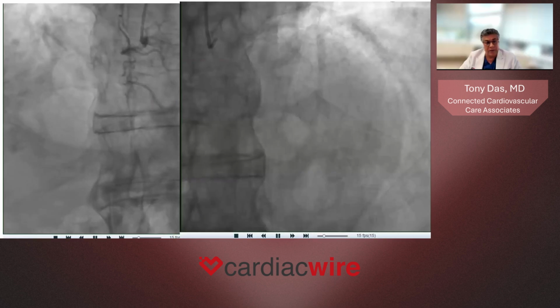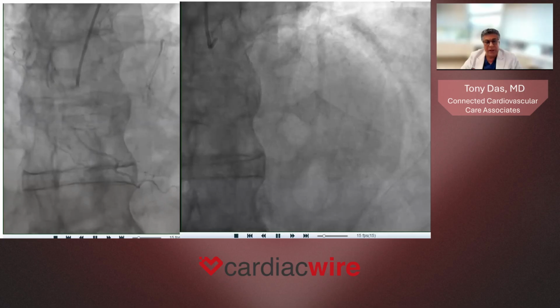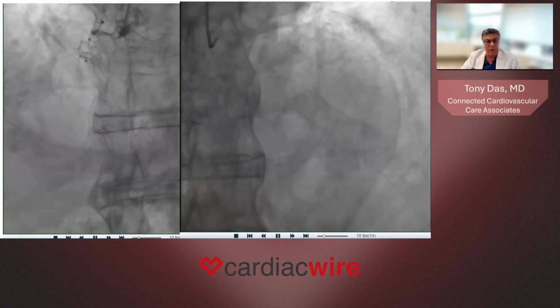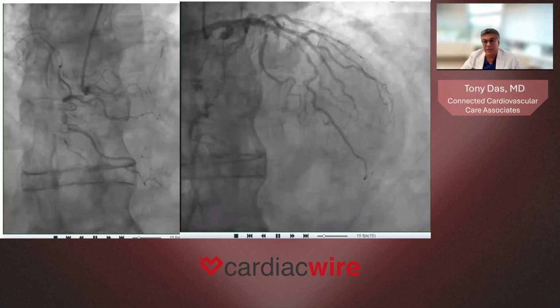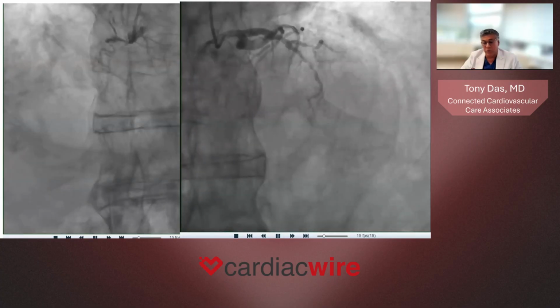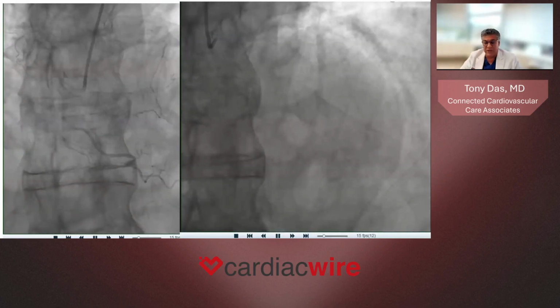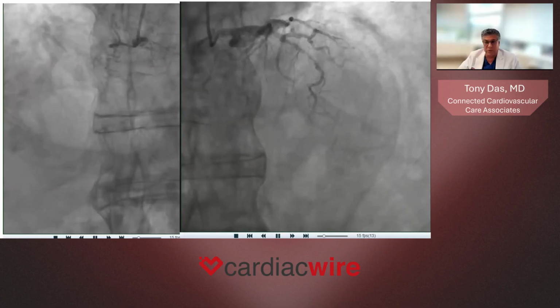The patient underwent an angiogram, and sure enough, this is an angiogram of the right coronary, which we can see is occluded. And you see septal perforators coming over to the LAD territory, and then this very heavily calcified proximal LAD stenosis, which would have been completely ignored in this 83-year-old patient, but had it not been for CCTA, we did determine that this was important.